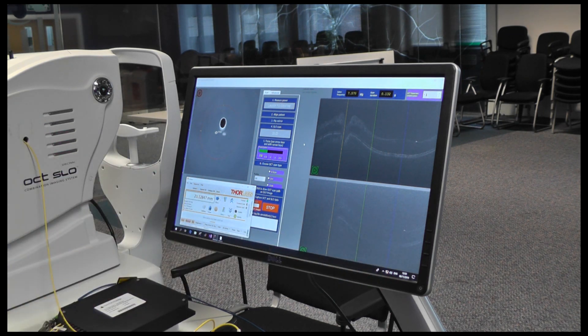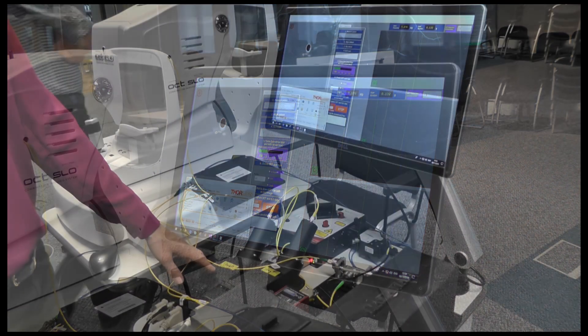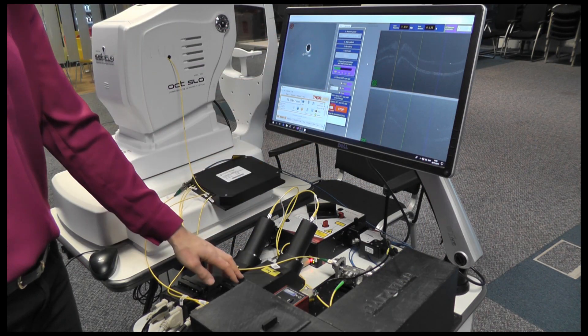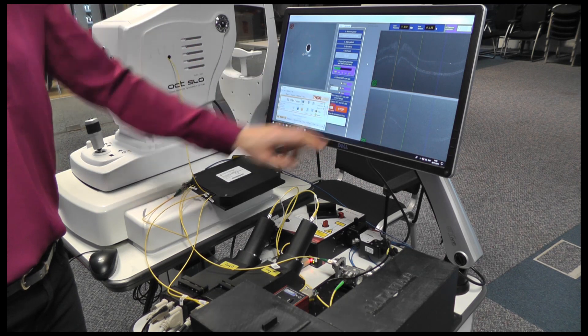That information is then displayed on the right-hand side of the screen, and you can see we have two polarisation channels, two spectrometers, to give us information about the polarisation behaviour of the light.